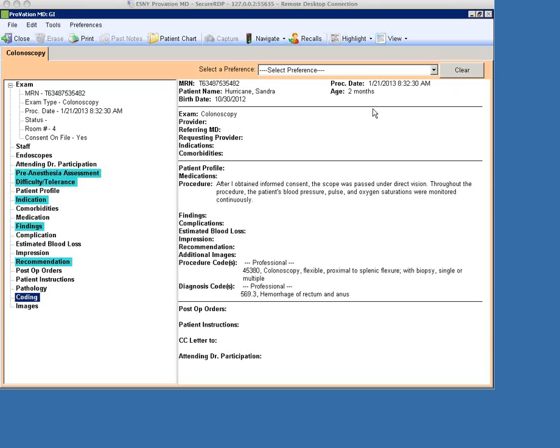As all of you know, GIQuIC has been utilized at Eastside Endoscopy now for approximately 6 months. This program has been transparent to the members as it runs in the background and extracts data from the colonoscopy reports that are generated using the Provation MD writer. The program extracts 82 data points from each procedure, and there are 10 quality measures that are uploaded to the system.